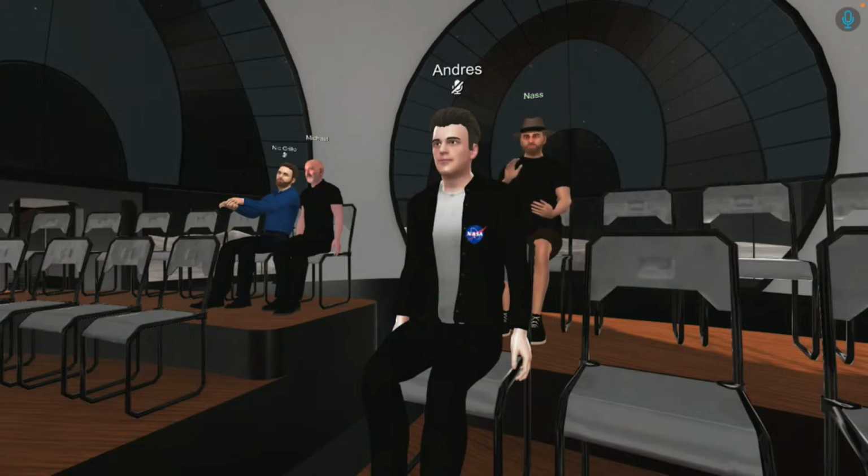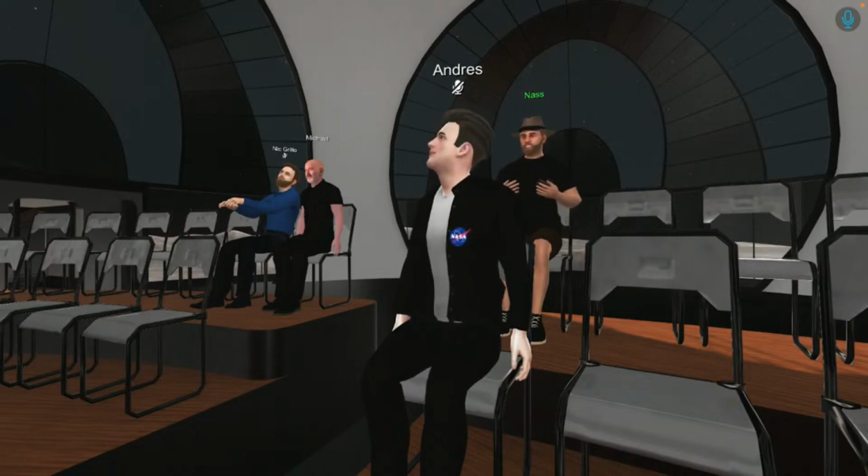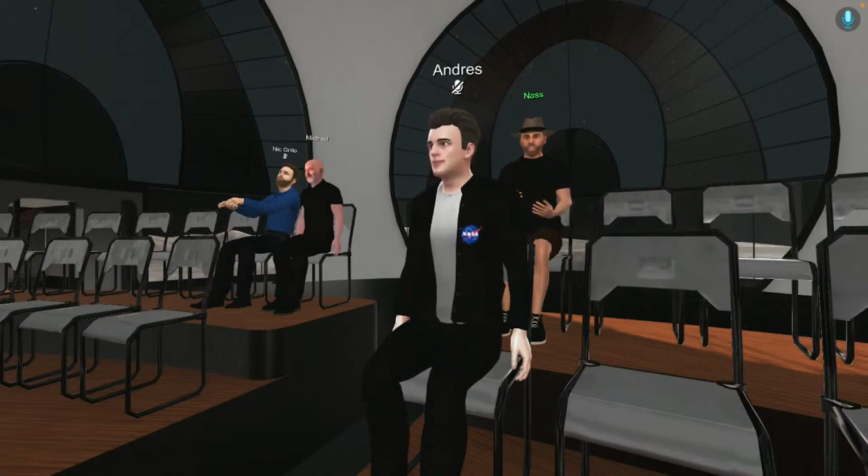I'll stop you, just a quick question. So do you just inject it and don't do anything else? You just wait half a minute, or do you move the eye or make a little bit of fluidics inside? At the moment when you instill the fluorescein, it starts to spread in the eye. You just wait, count to 10.